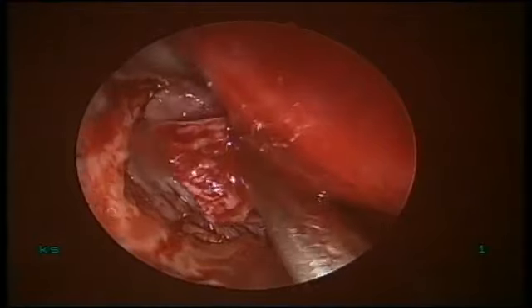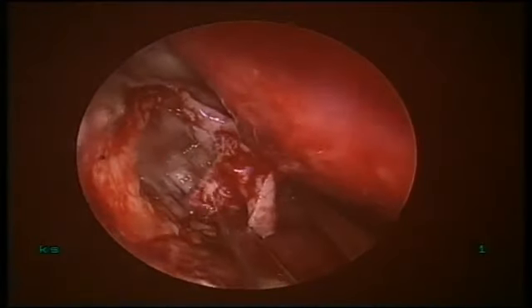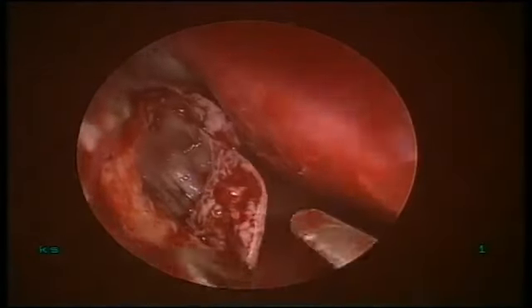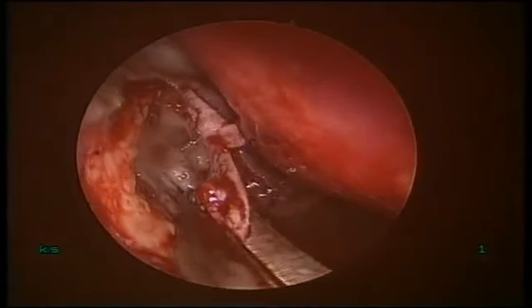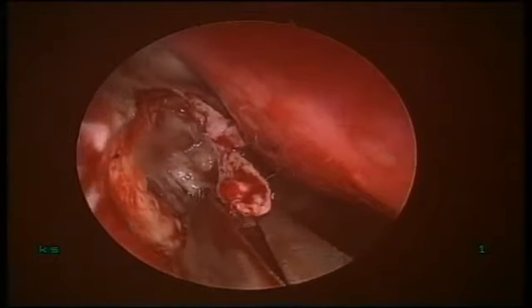See what I am going to do. I will divide it into two horizontal flaps.